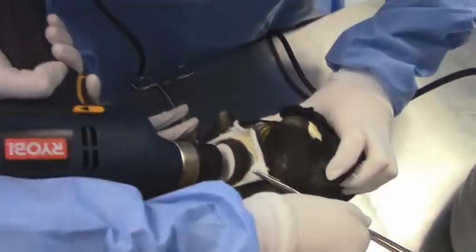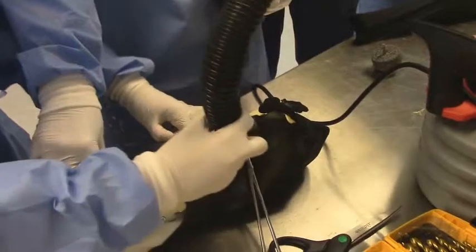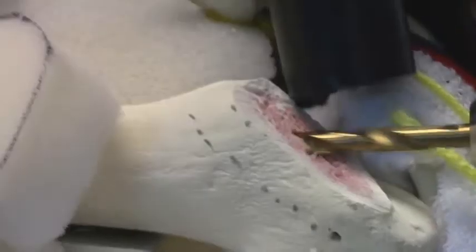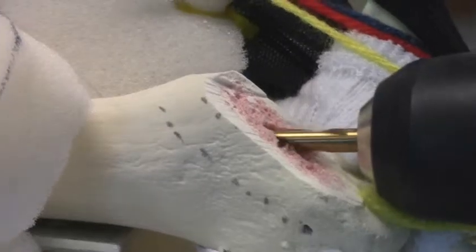Ream the acetabulum and be sure to remove any dust formed by the process. When the particulate falls on the floor, it can be very slippery, and the dust is just a mess in general. It coats everything. Now turn your attention to the proximal femur and begin by drilling along the axis of the medullary cavity. Progressively widen the hole with larger bits and go slow.